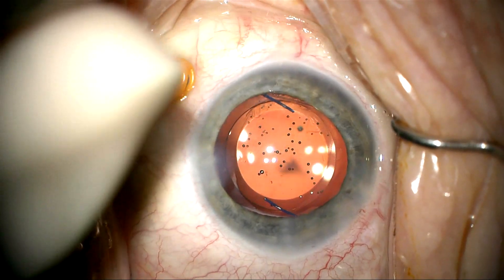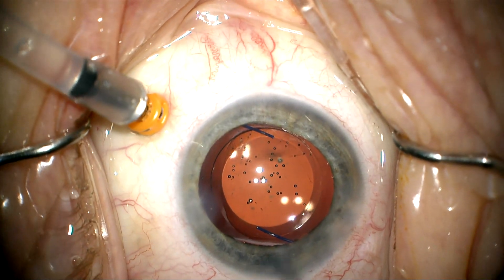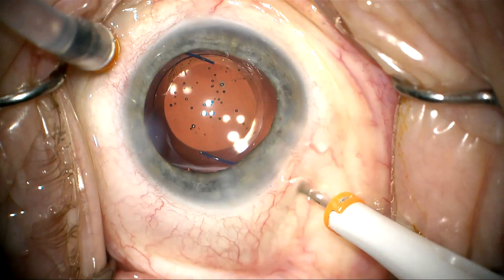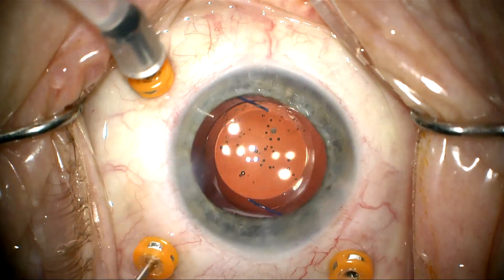Here I'm placing my first pars plana trocar and an infusion line. The second and third trocars will be placed 3.25 to 3.5 millimeters posterior to the limbus. As I do my pars plana vitrectomy, you can see all these vitreous opacities that she has — these are all going to be removed with the vitrector. We can see the peripheral retina very clearly here, and I'll go ahead and clean out the vitreous and inspect the peripheral retina as well.